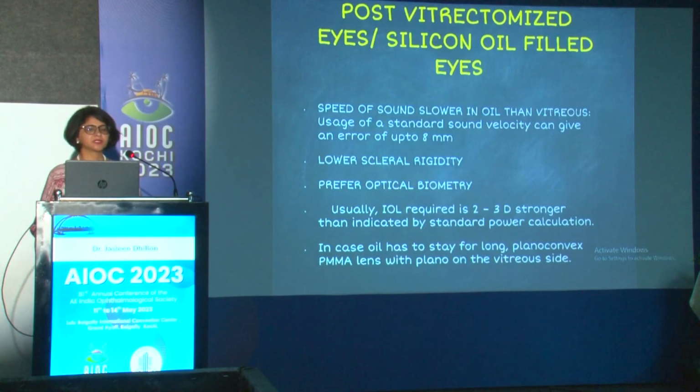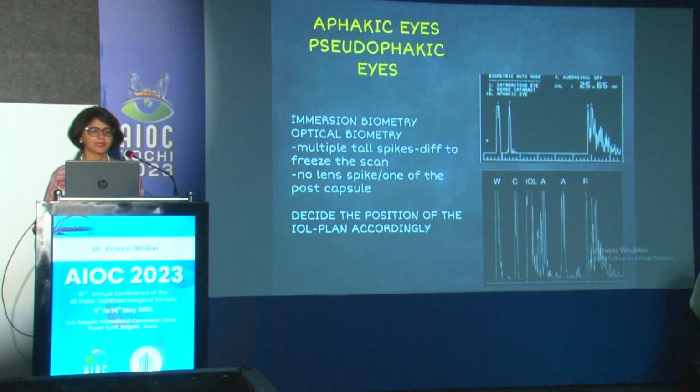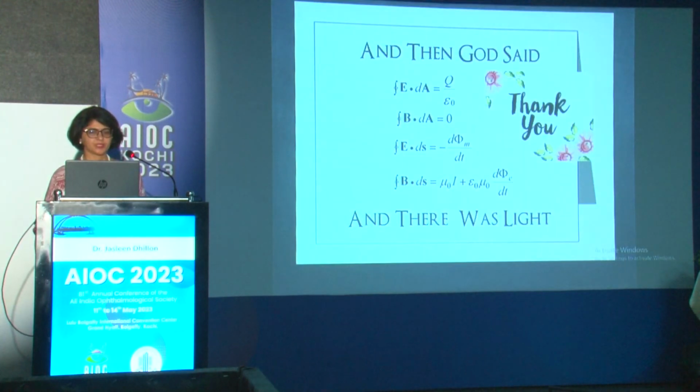And in silicon oil filled eyes, the refractive index is going to be affected, so there is an error if you do not modify the power. Usually the power required is 2 to 3 diopters stronger than the standard power. And I think I will just close it here.